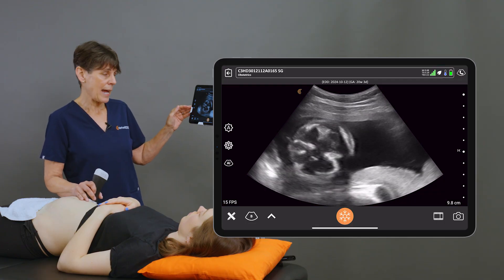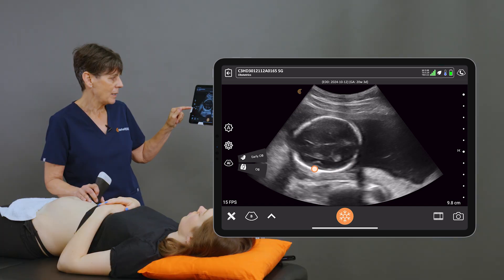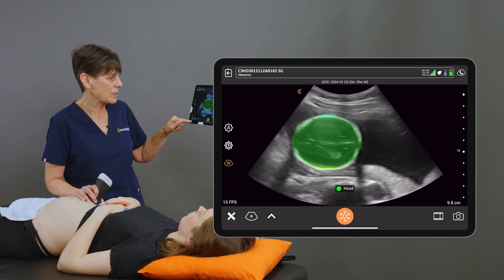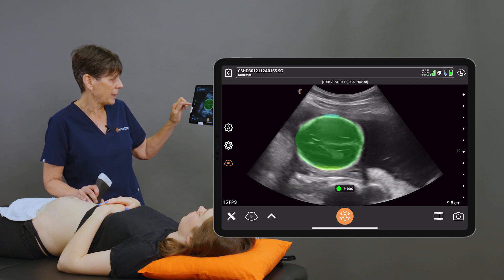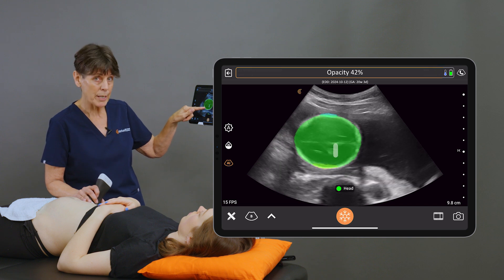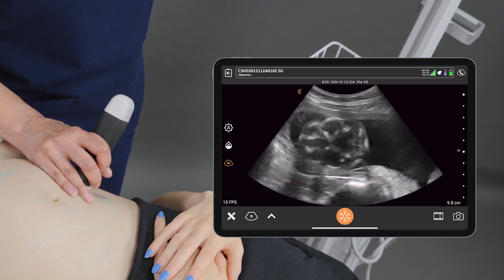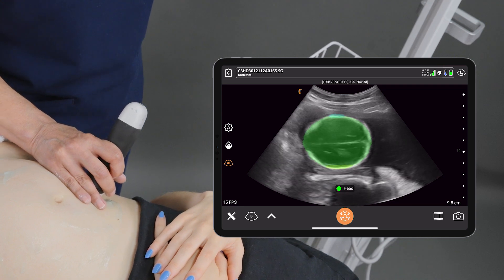I'm going to start off at the fetal head, and we'll get an image at the level of the head, then I'm going to activate the AI by selecting the OB option, which indicates second or third trimester measurements. Right away, you'll see that the AI has recognized this as the fetal head. I can go in and adjust the opacity of that mask if I like a brighter mask. If we scan through the head and go too low at the base of the skull, the mask disappears, indicating that I'm not at the right level to measure the head — same as if I'm up too high.